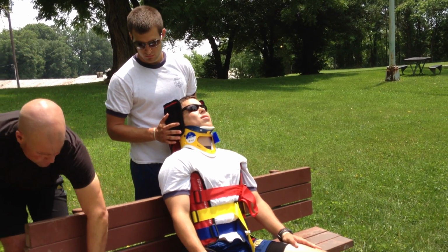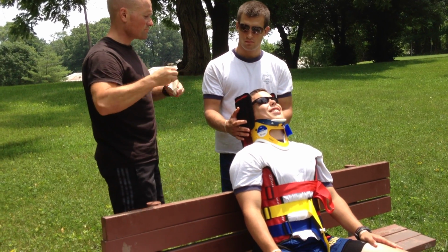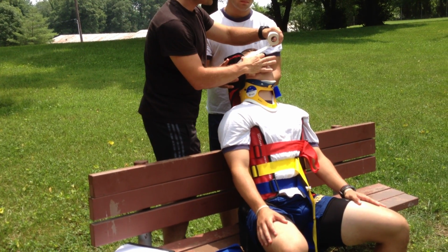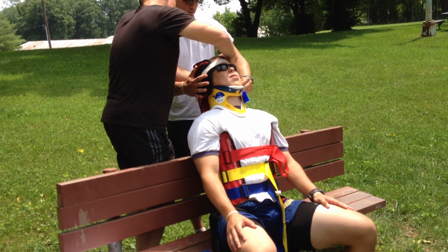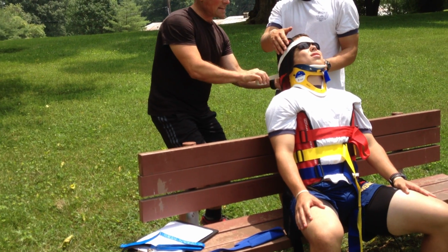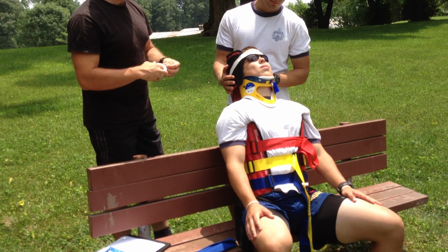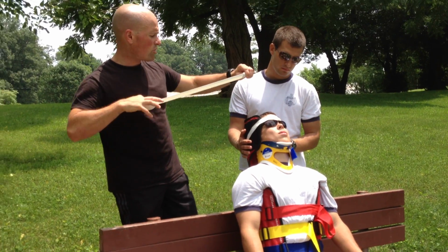A method that works just fine is to use the same thing we do with a backboard, some nice medical tape. Same guidelines as before. We'd like to do some sort of tape that's going to hold the device where we want it and yet not remove the patient's entire eyebrows. Since the tape doesn't stick super well to the Velcro, it might pay to cross the tape in the back so that it holds itself down. If one strap gets it done, that's fine. I myself prefer to do that same chin strap that you saw Paul do.